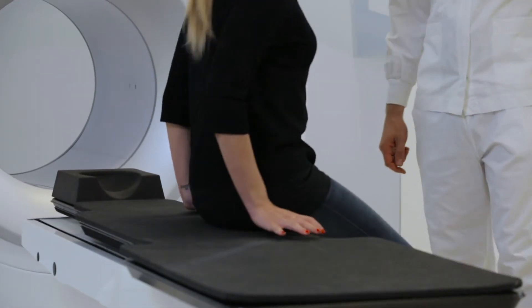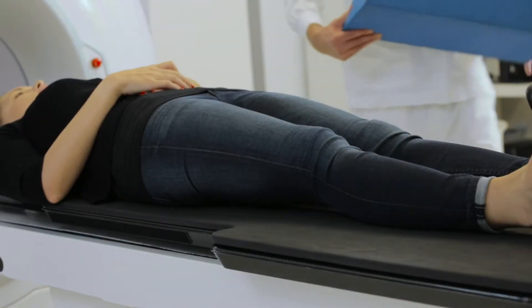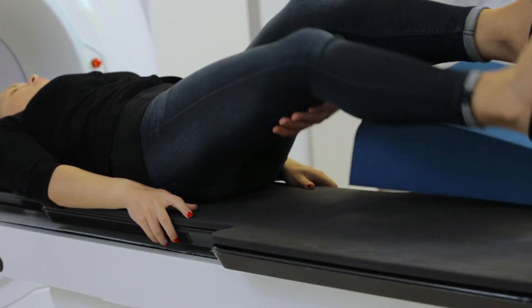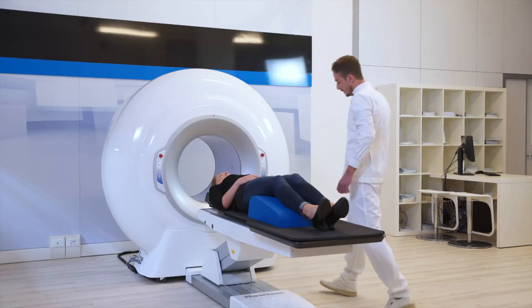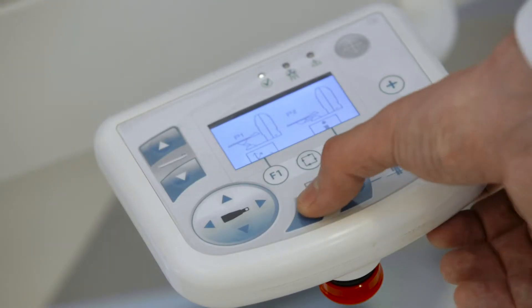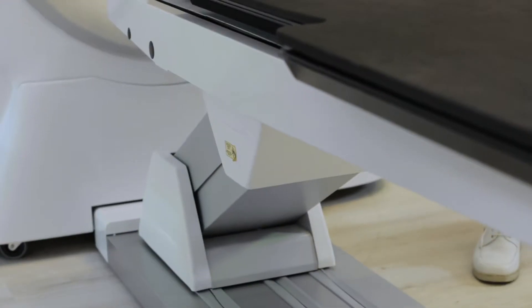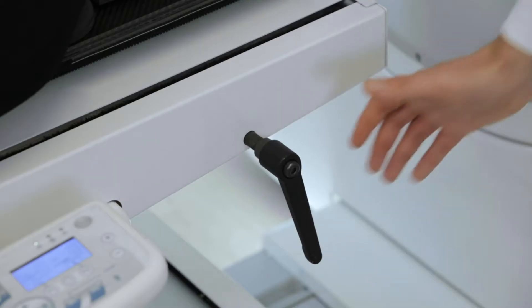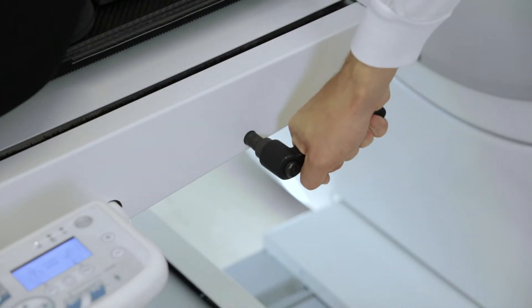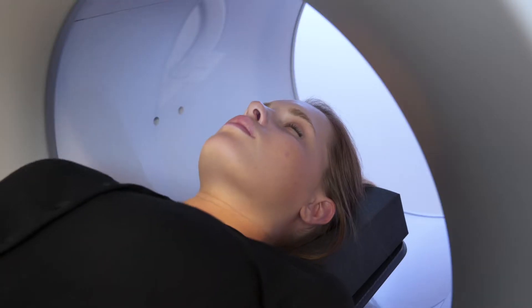Now the patient can sit down. Once the anatomical region to be examined has been selected, the patient must be brought to the scan preparatory position by pressing the P1 key. Unlock the gurney and slide it to move the patient into the gantry, then lock it again.